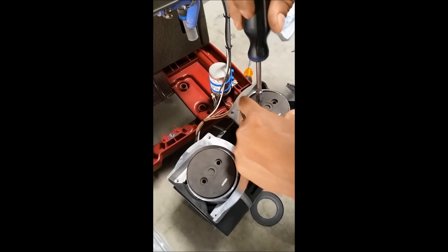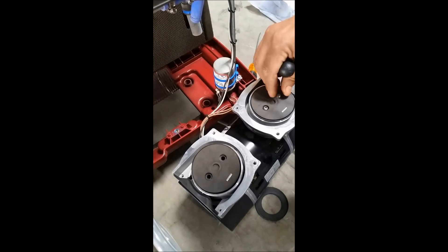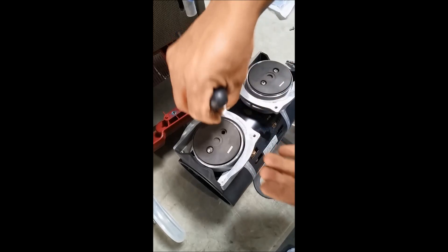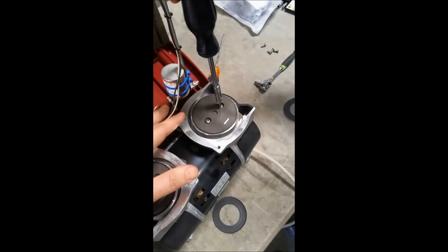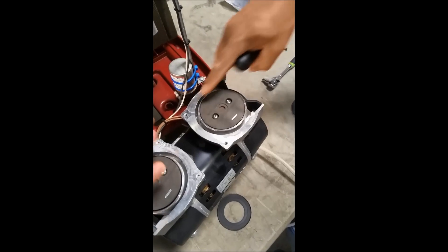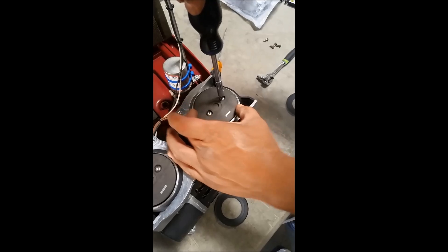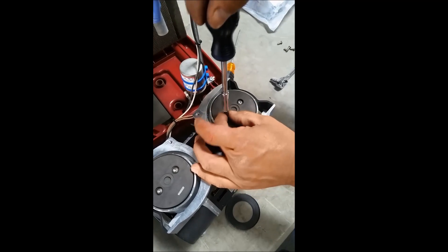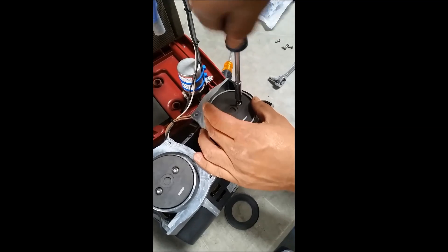Grab the screws that came with the compressor rebuild kit and place them inside, just reversing the process of what you did earlier taking it apart. It is important to keep these seals even — you don't want any air rubbing around here. So you want to go back and forth, screwing two or three times on one side and then two or three times on the other until your seal is all the way down.